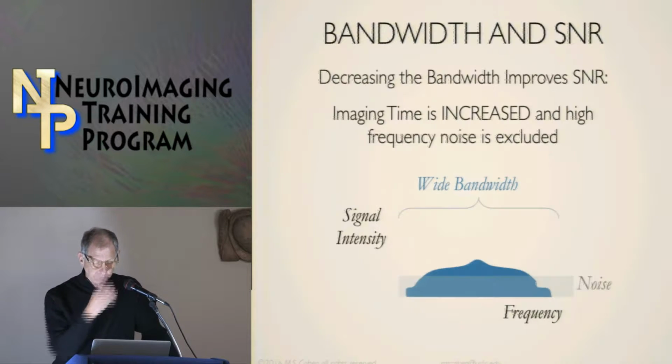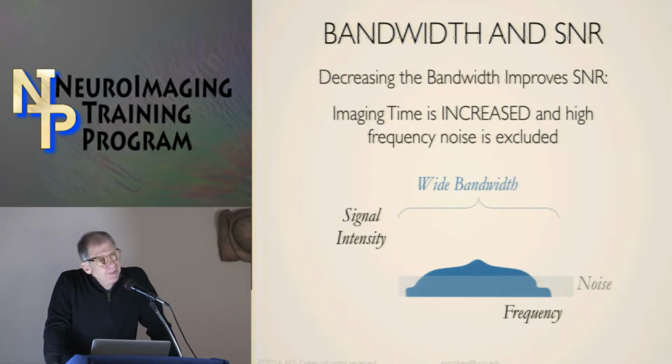Okay. Another topic that appears to the users at the scanner is something called bandwidth. How many people here in this room have noted a bandwidth parameter when they set up a scan? Yeah, about half of them, okay. So it's always available on the console.